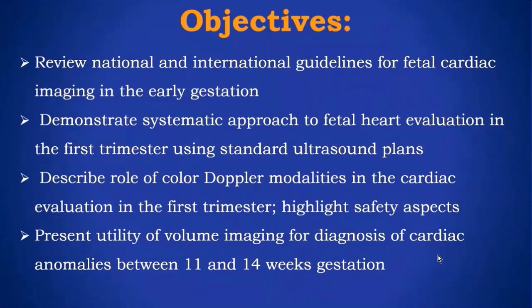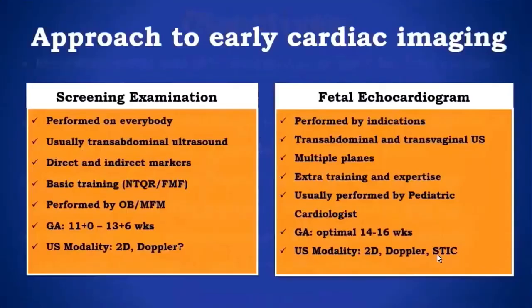We will describe the role of the different color Doppler modalities in the cardiac evaluation in the first trimester, and spend some time highlighting the safety aspect to make sure that we eliminate any anxiety related to use of color Doppler in early gestation. And I will present also the utility of the volume imaging for the diagnosis of the cardiac anomalies between 11 and 14 weeks gestation. So we have a very ambitious plan for today.